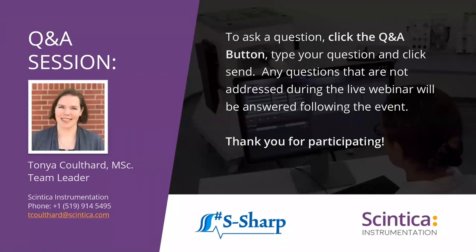When the heart rate goes above 500 or 550 beats per minute on a mouse, those two things are happening almost simultaneously, and being able to resolve the E and the A peak becomes exceptionally difficult. There's not a lot that can be done in terms of the heart rate, because you do want to make sure that the heart is functioning as close to physiological as possible. But again, it doesn't have to do with the resolution of the probe.